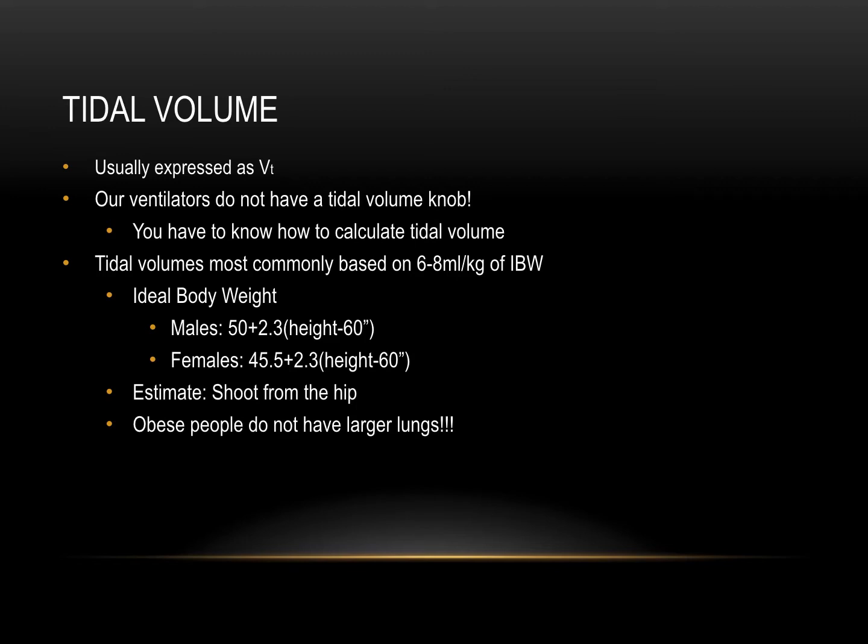So what I do is I use myself as an example. I know what my ideal body weight is. I'm going to look at someone and let's say they're 5'5", 150 kilos. So we know that that person's not anywhere close to their ideal body weight. But if I'm 5'9", I'm 4 inches taller than they are, and I'm going to figure that their ideal body weight's somewhere around 60, 65, right?